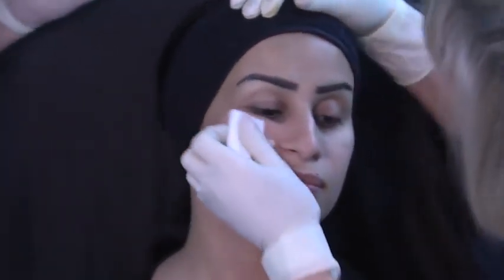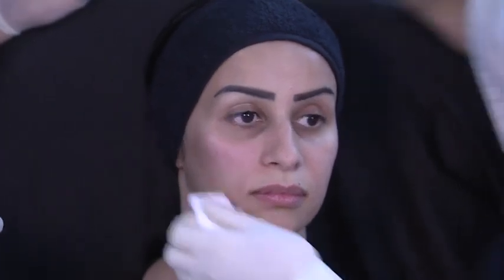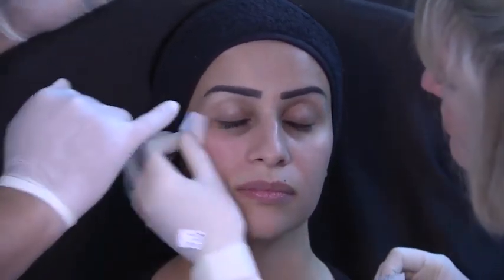So the product I'm going to use for the tear trough is the product that has the lowest concentration of HA. For the tear trough, I prefer products that have a lower concentration because I don't want any retention of water and I don't want any Tyndall effect in this area. So my product of choice is Vital Light.